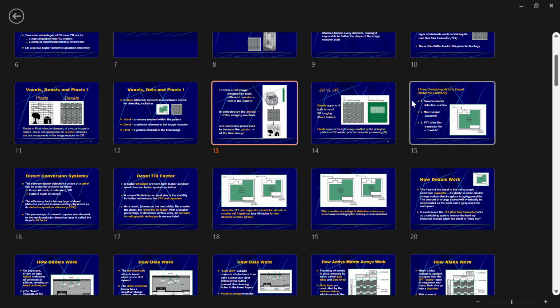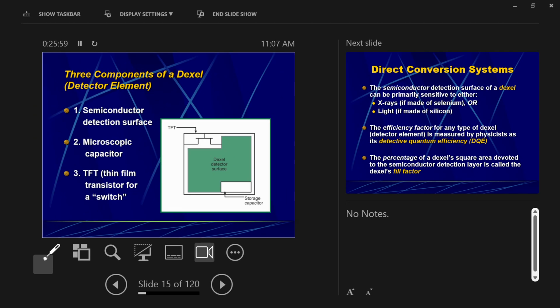All right, so we're going to get a little bit technical now. We need to zoom in and look at a single dexel to see what's going on inside of it. Remember, this square dexel is 1/10 of a millimeter across. They're teeny tiny. So picture your pinky nail, roughly a square, split up into 100 dexels wide and 100 dexels tall.